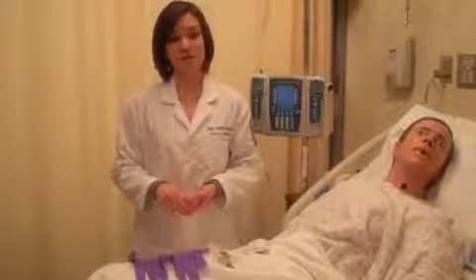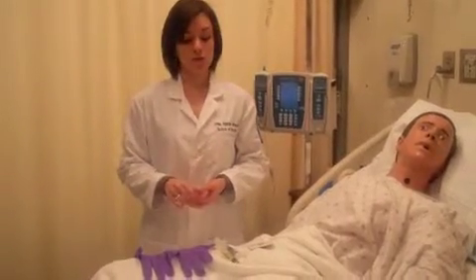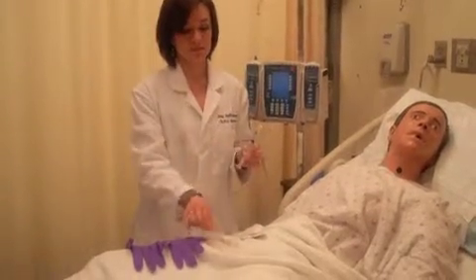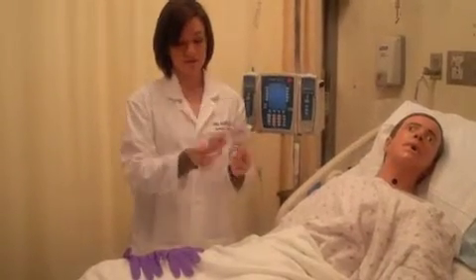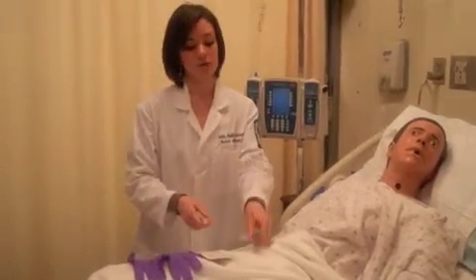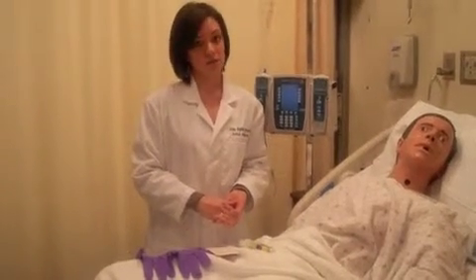Hi, I'm Amanda. I'm a nursing student, and I'm going to show you how to flush a central line. What you need to flush a central line is normal saline, heparin at 100 units per milliliter, alcohol swabs, and gloves. And the reason we flush a central line is to ensure that it doesn't become occluded with any fibrin sheaths or clots. Usually hospital protocol dictates that we flush the line every 8 hours. However, you should check with your institution to be sure.